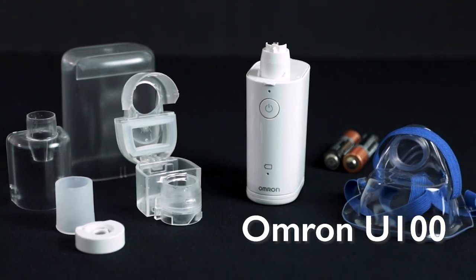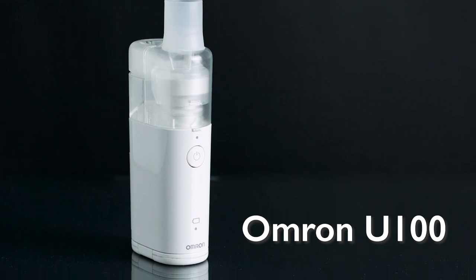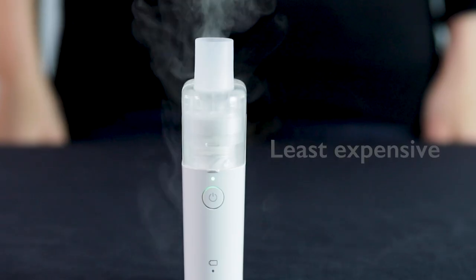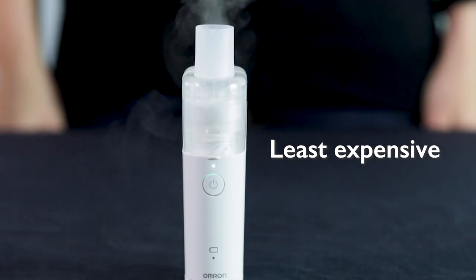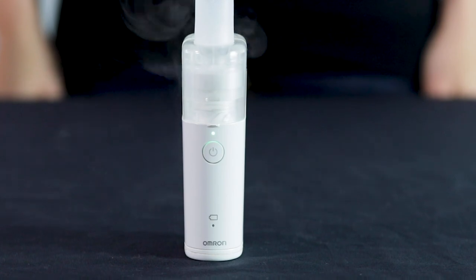The Omron U100 is made by the same company that makes the popular Omron Microware. It is just a little bigger than its predecessor, but remains a high quality product. The U100 is the least expensive of the new units, and it is cheaper than its predecessor even after the rebate.